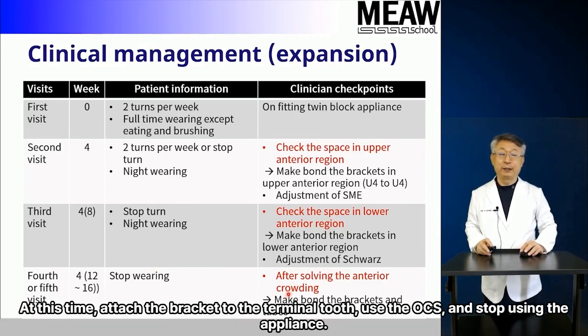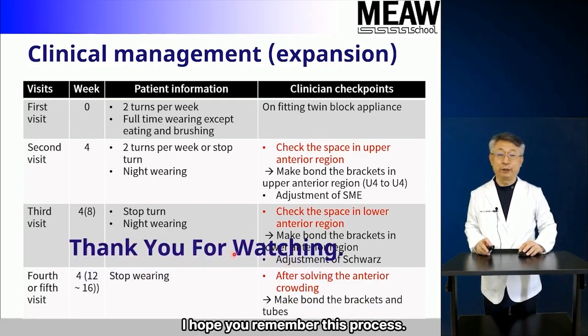At this time, attach the bracket to the terminal tooth, use the OCS, and stop using the appliance. I hope you remember this process.